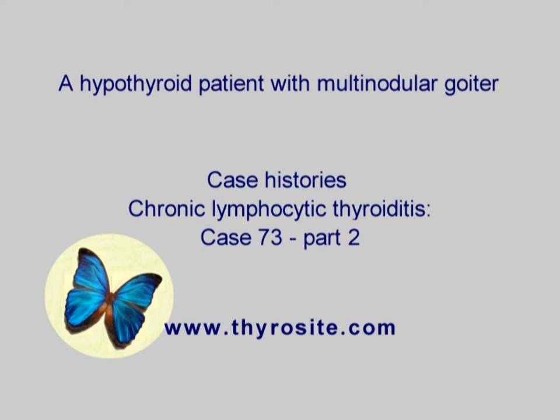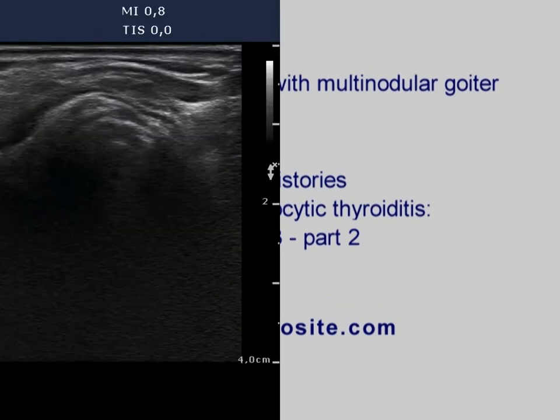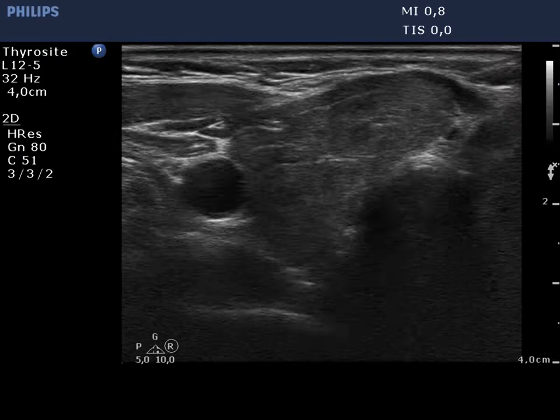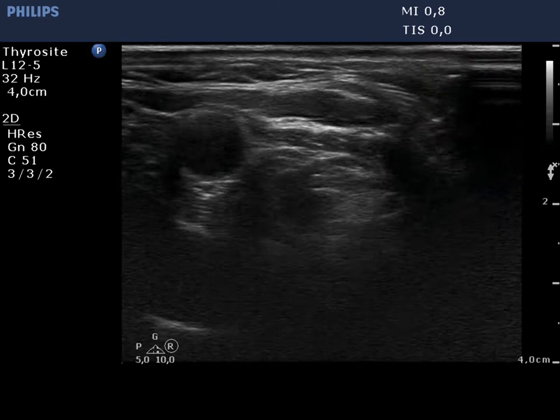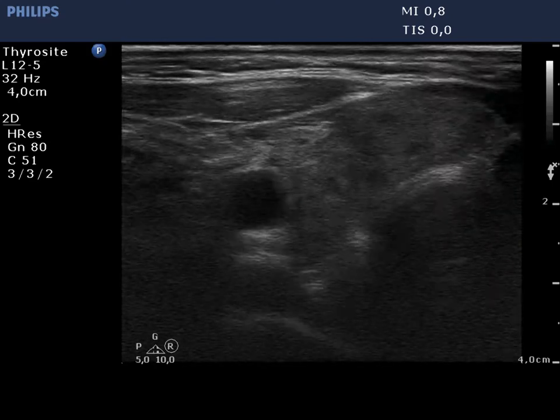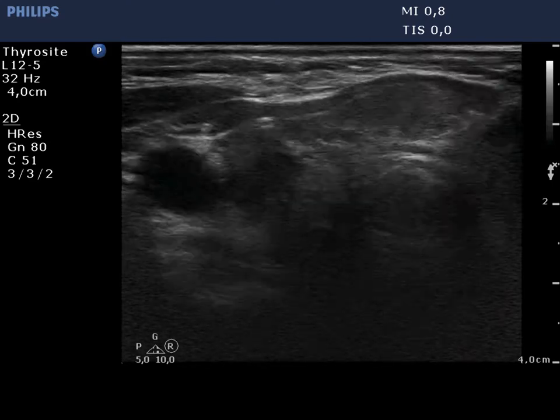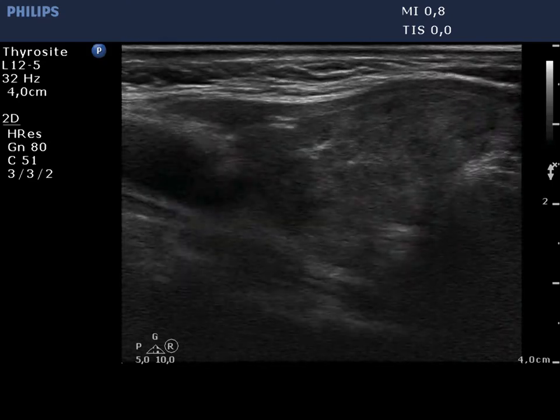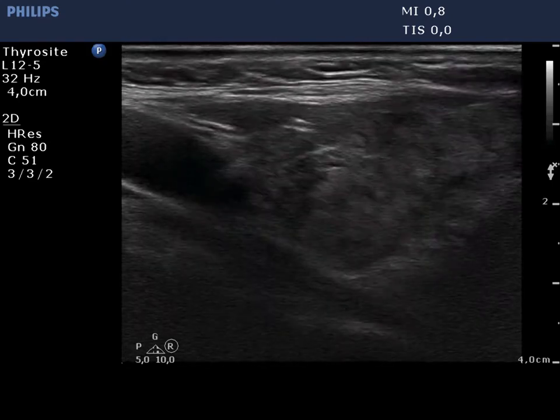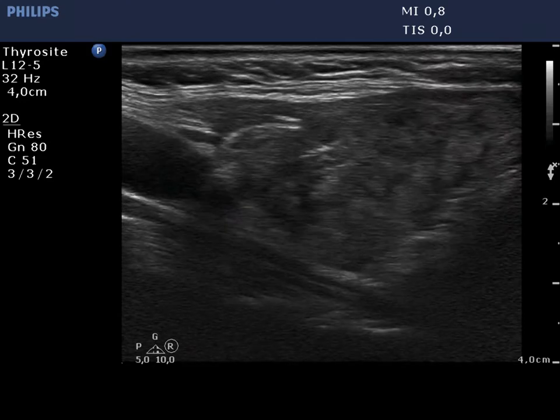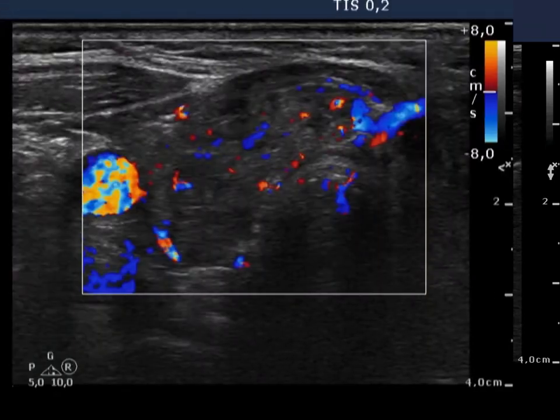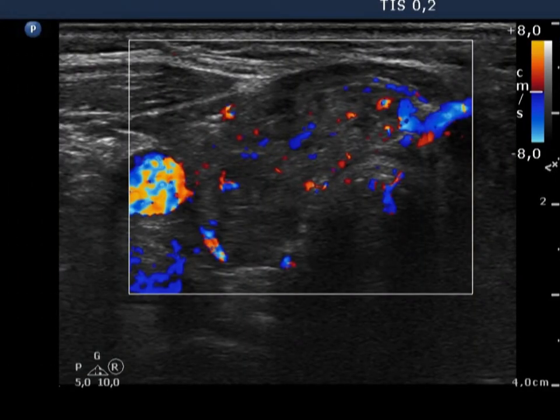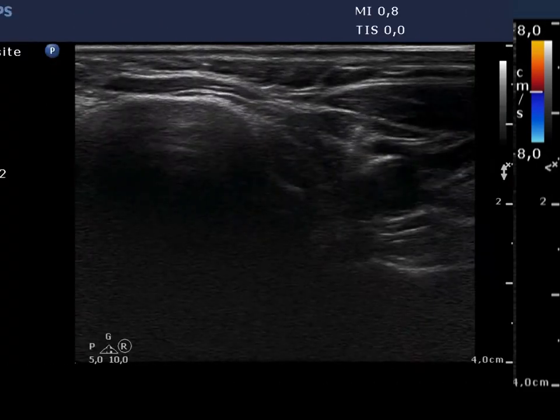The thyroid presents the so-called micronodular or pseudolobular pattern of Hashimoto's thyroiditis. Small echonormal areas with a maximal diameter of 5 to 15 mm are found in a hypoechoic background. The vascularization is not specific.